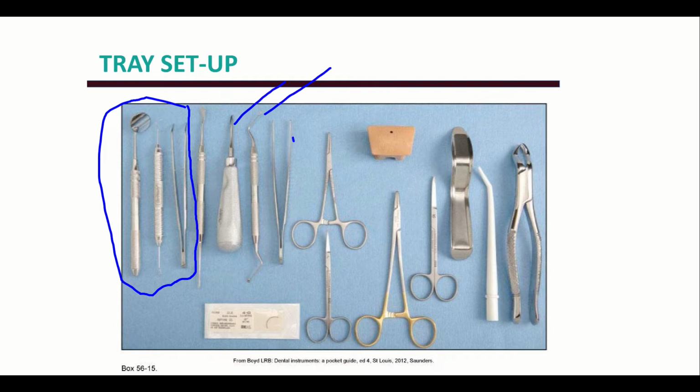You have some cotton pliers, of course. These are called hemostats, H-E-M-O-S-T-A-T, hemostat. These two right here, and you can tell that they're basically a cotton plier, but they have a little lock right here, so you can put something in it, such as a needle, and we'll talk about that in a minute when we talk about sutures, and lock them into place in the hemostat.